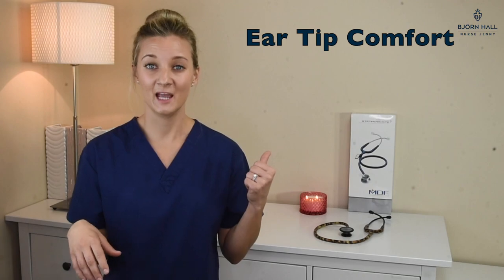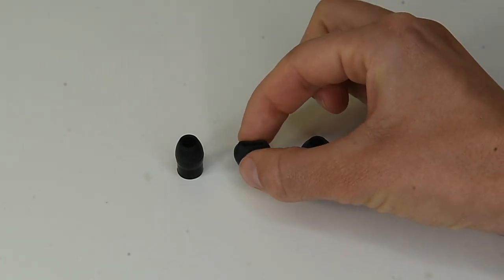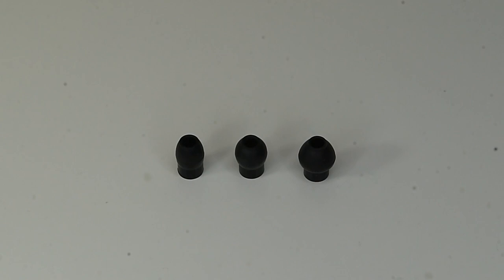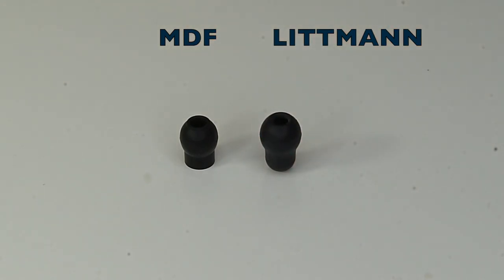Eartip comfort. The MDF 777 comes with three different size eartips, which is great if you have small or very large ear canals. The shape of them is like a bullet, so I found they don't fit as snug as the Littmann ones, which are round. The round ones drown out noise a lot better, but this is a personal preference, and for you this might be a perfect fit. I've given it a good score of four out of five.